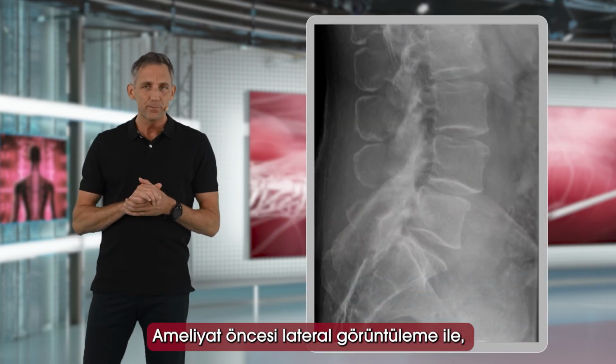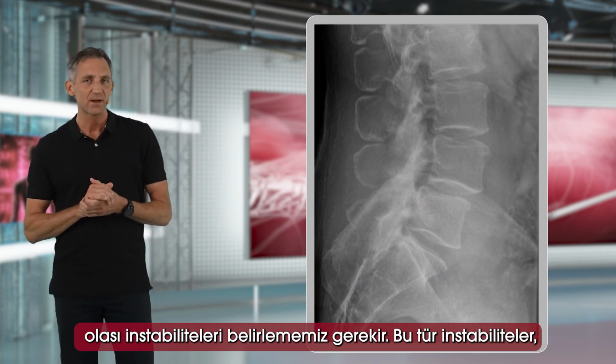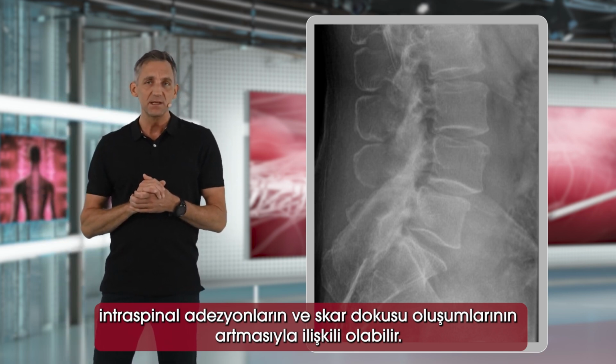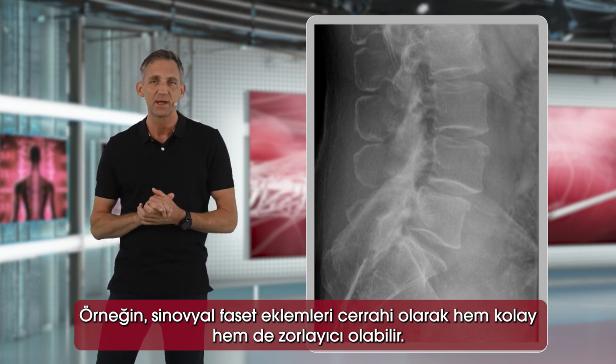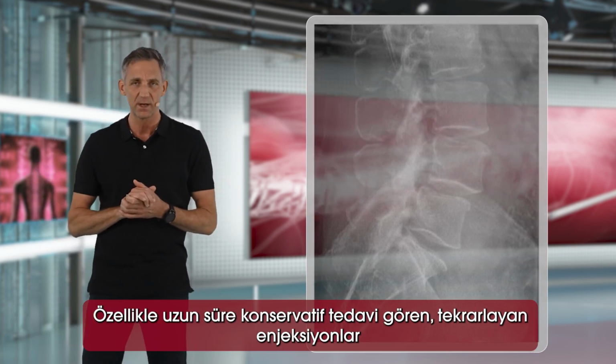In the lateral view, prior to our surgery, as part of our preoperative planning, we check for any potential instabilities. These instabilities may be associated with increased intraspinal adhesions and possibly scar tissue formations.